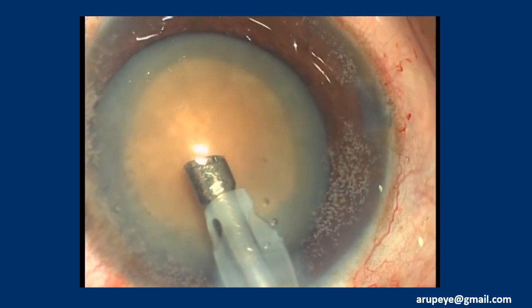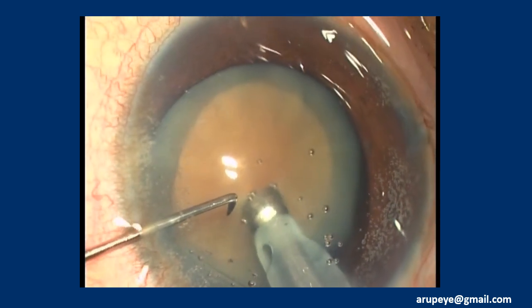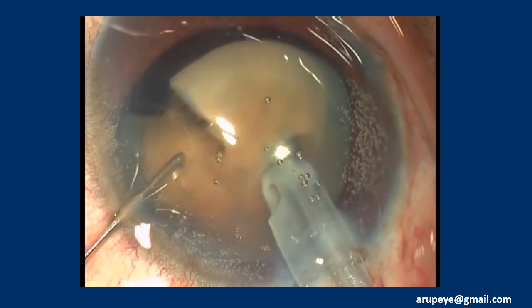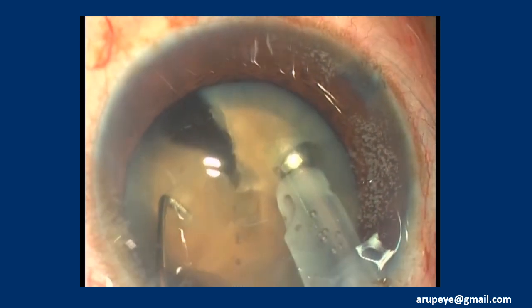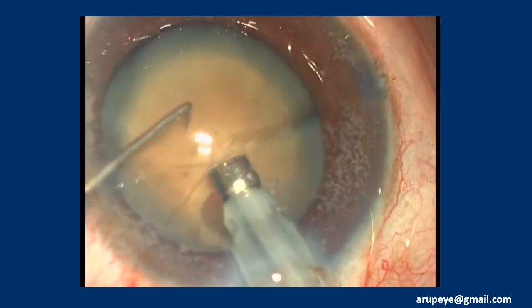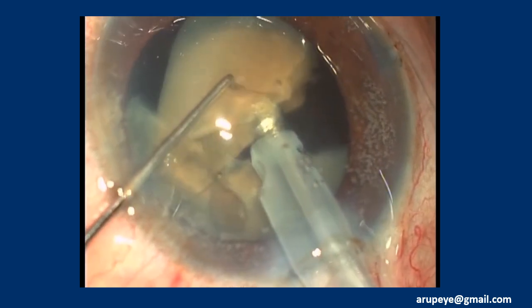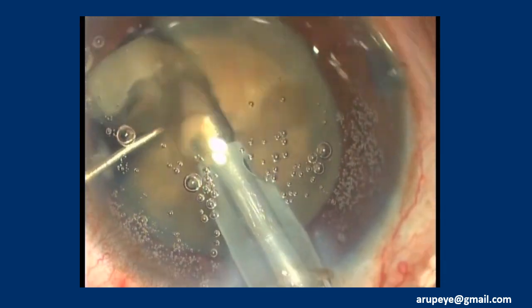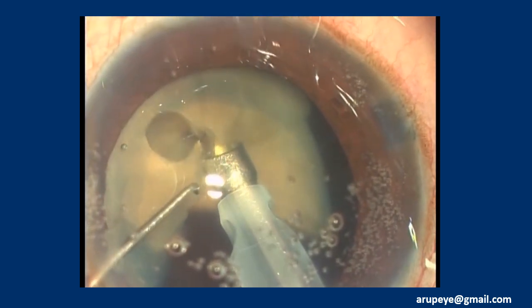Disassembly of the nucleus becomes challenging due to its excessive in-the-bag mobility and a direct exposed status of the posterior capsule to the phaco tip in the absence of cortex and epinuclear bowl. The posterior capsule tends to be quite floppy in many situations. In this case, an oblique chop technique is employed using the Guyot mega tip and the sharp, long Chang chopper. The mega tip has been buried deep into the substance of the central nucleus. The distal peripheral margin of the nucleus disc is lifted and marginally centralized before chopping is initiated. All manipulations are confined to the central bag, thereby avoiding undue stress to the capsule which is transmitted to the zonules. The phaco parameter settings should be just right to ensure a proper hold on the nucleus as chopping continues.